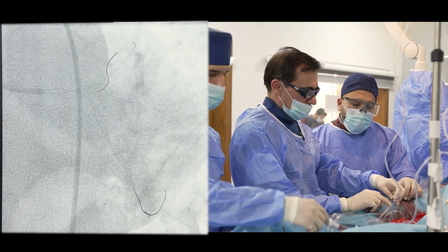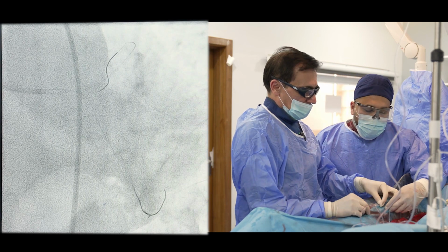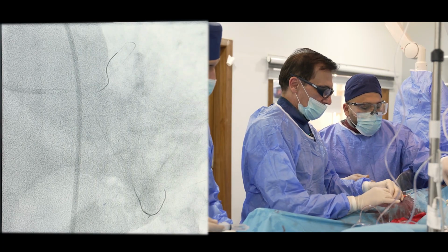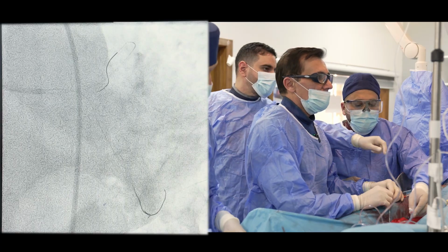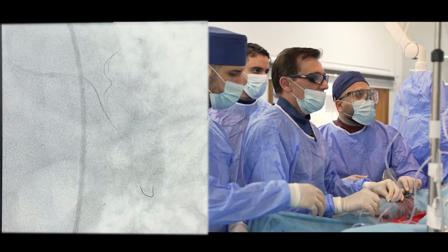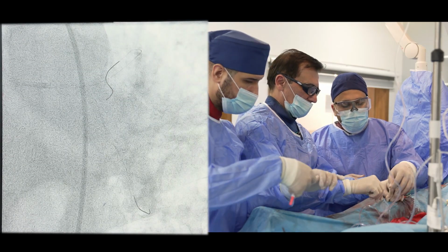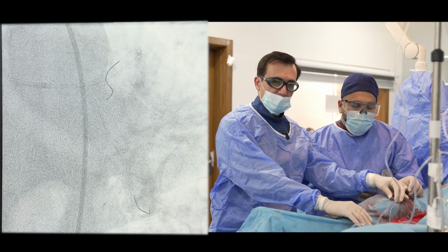Balloon 2. Which one is the circ? With the torque. Okay. I'm second time here. Okay. Out. Take this wire out, yes. Okay, this is the circ, balloon 2.